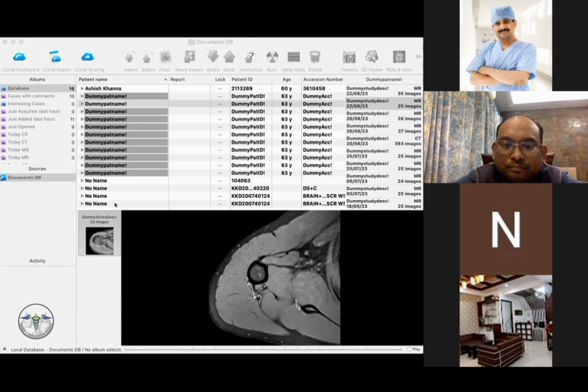Other important things, like you already mentioned, we should know about other related things, like whether there is a rotator cuff tear or a posterior tear. Many times we are seeing posterior labral tears along with it. So those things are becoming more and more important, because then we can plan accordingly. Like if we are seeing a posterior labral tear, usually then we won't be doing a remplissage. Right. So that is where planning comes in.